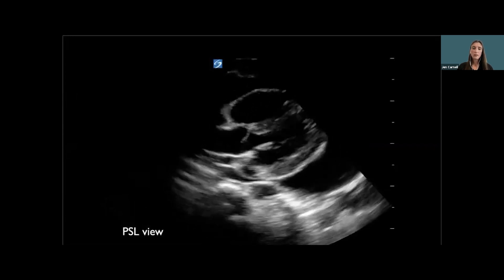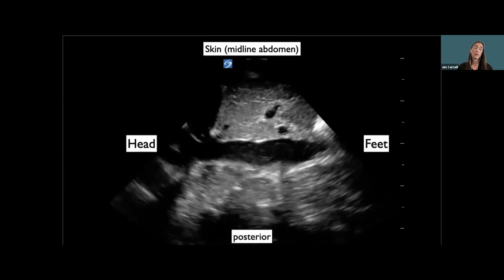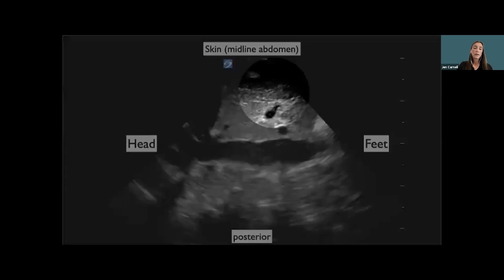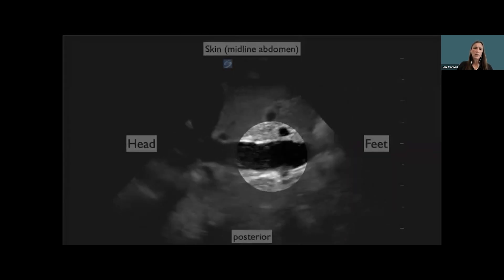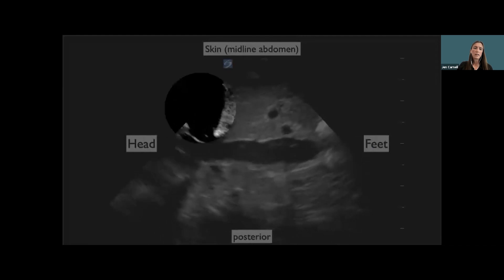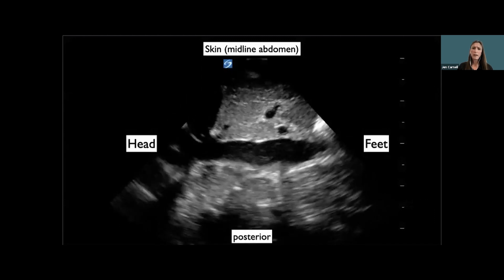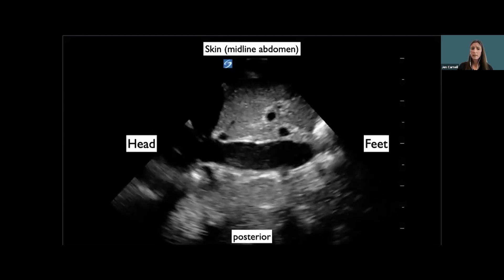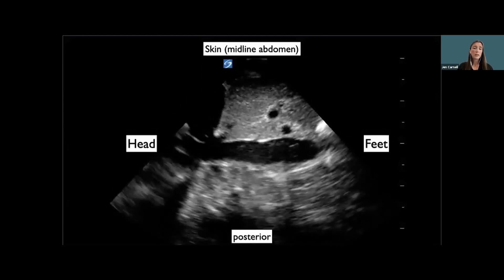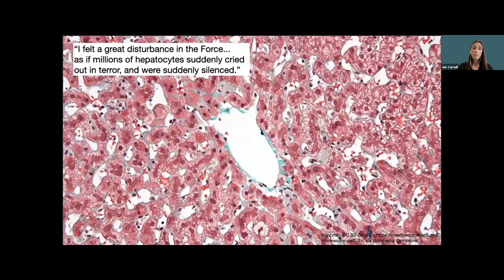It's also important to look at the IVC — this is part of the diagnostic criteria for tamponade. Here I can see a big plethoric IVC headed into the heart, with all the pericardial fluid right there. The reason this young guy wasn't complaining of chest pain is because he had really bad hepatic congestion — new to him, really stretching that capsule — and a lot of right upper quadrant pain as a result.